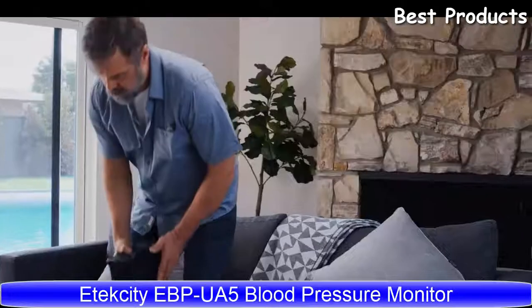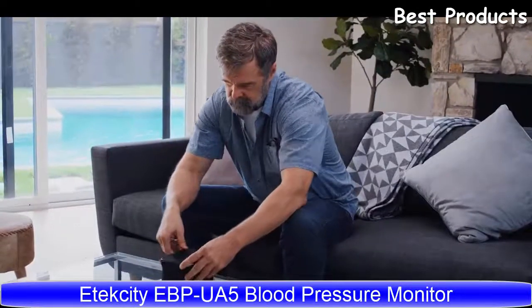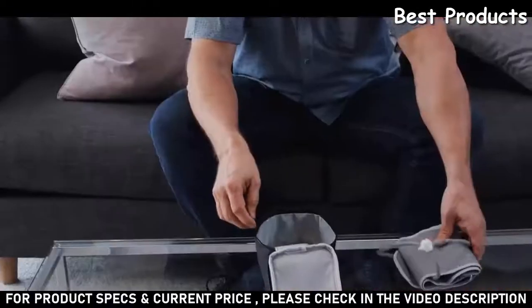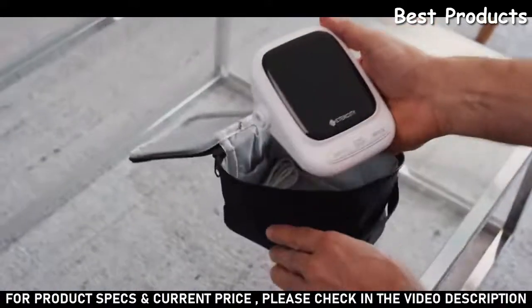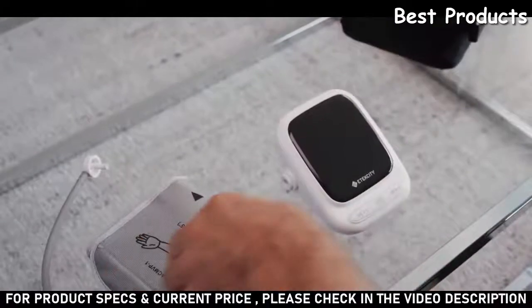When it comes to testing your blood pressure, you want a device you can trust. That's why E-Tech City's EBP UA5 Blood Pressure Monitor is the safe choice. It's small, easy to use, and reliable.